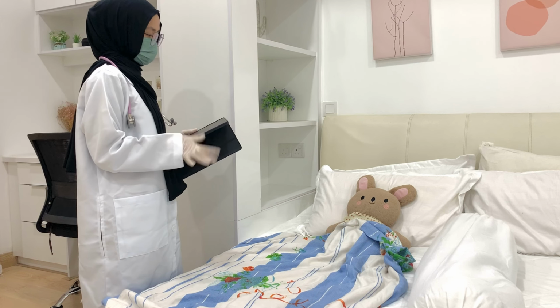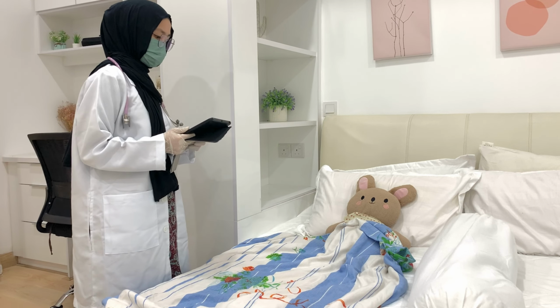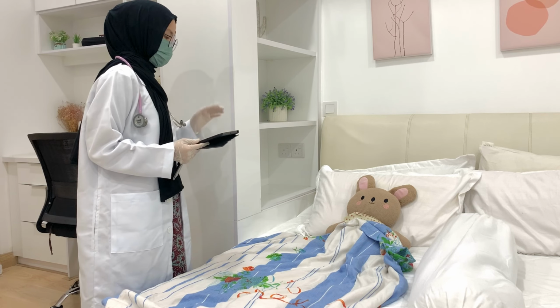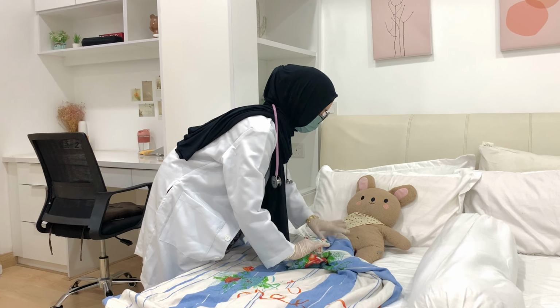Hi Miss Luna, I am your nursing assistant today, so I'm going to be checking your drain, which is your catheter. Is that okay with you? Alright, so I'm going to check the site first.